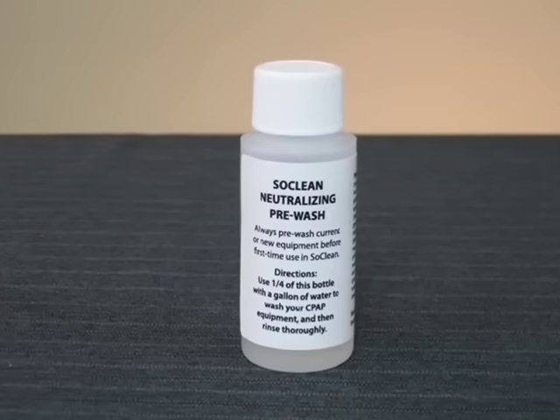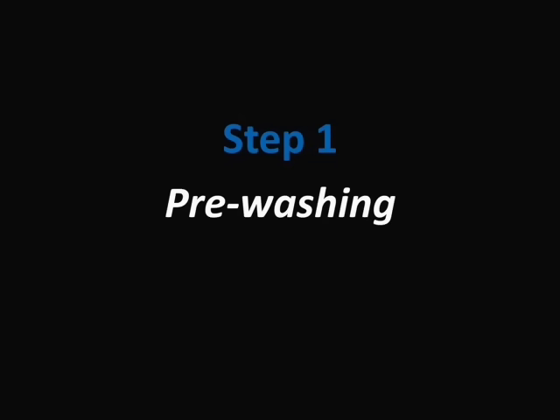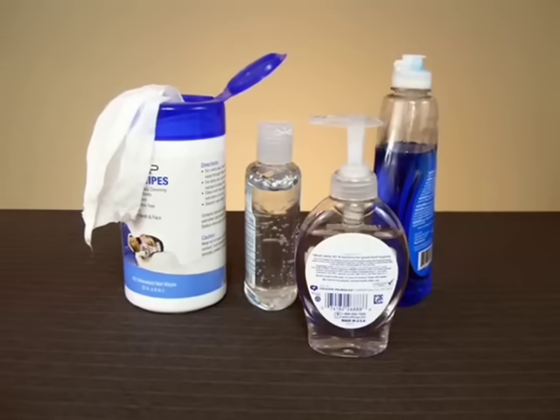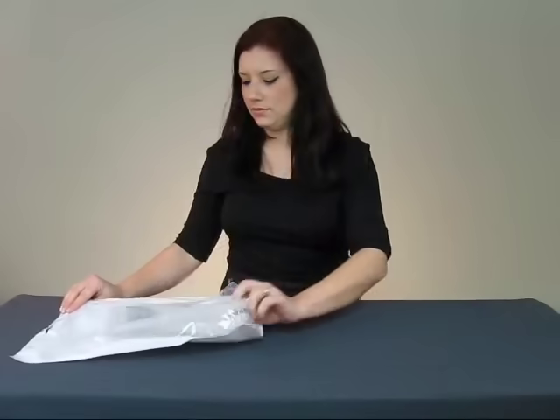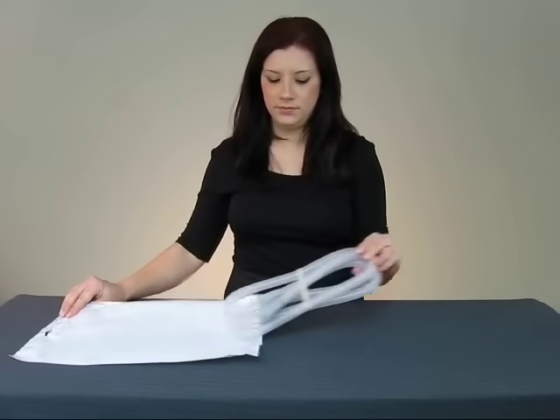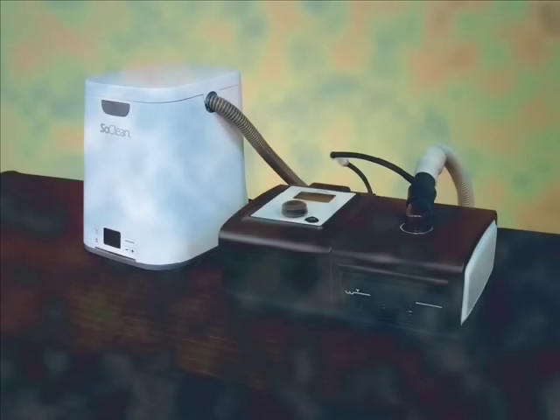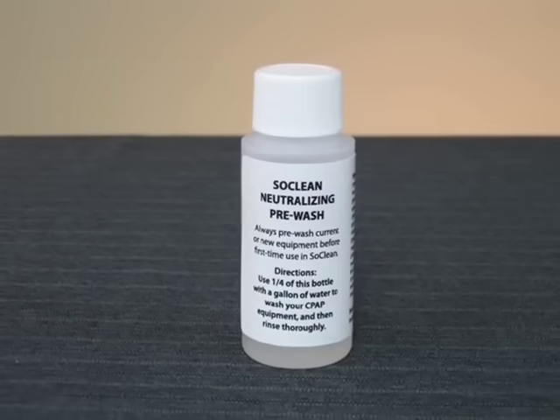Also included is a bottle of neutralizing pre-wash. Sometimes, cleaning agents you may have used can leave behind a fragrance. Or perhaps you received new equipment that may bear traces of manufacturing residue. Both of these can produce an off odor when used in the SoClean, so we've provided a special neutralizing pre-wash to eliminate that possibility.